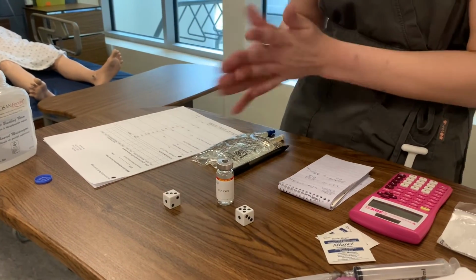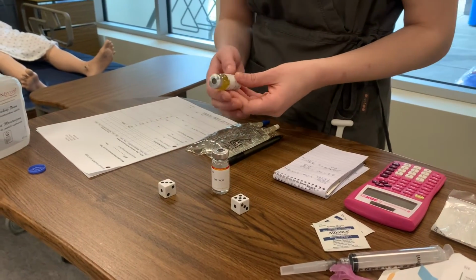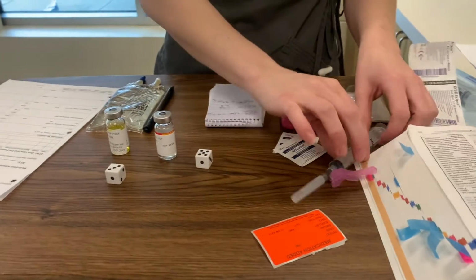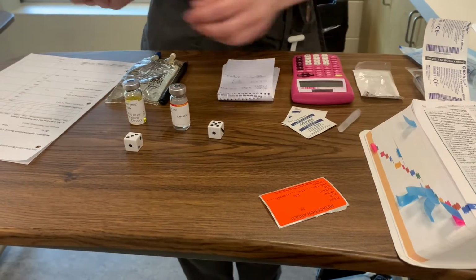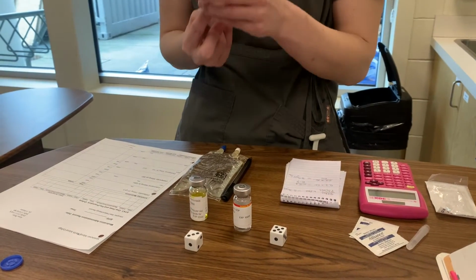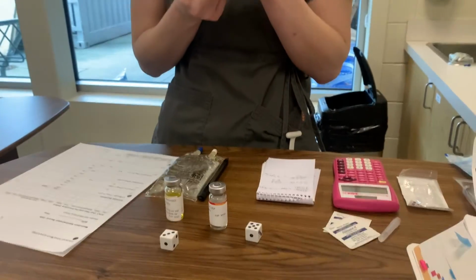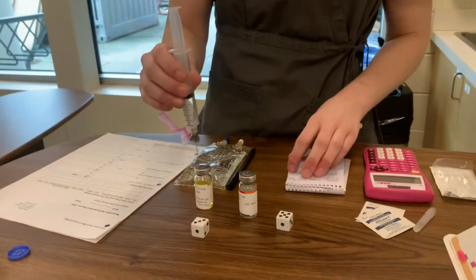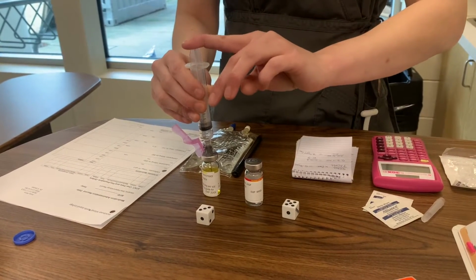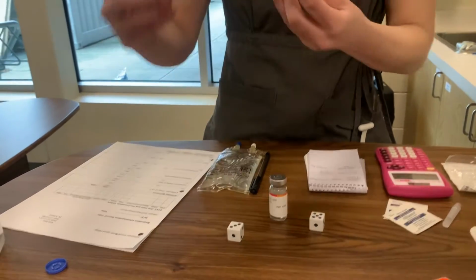Wonderful. Okay, and then I'm going to fill up my 5.3 milliliters of my injection here. So I'm going to pull back 5.3 on here, which is right in between the 5.2 and the 5.4 line. So there we go. And I'm going to go ahead in there and pull back.